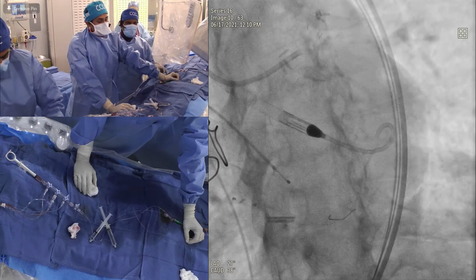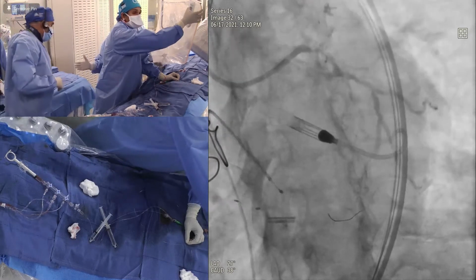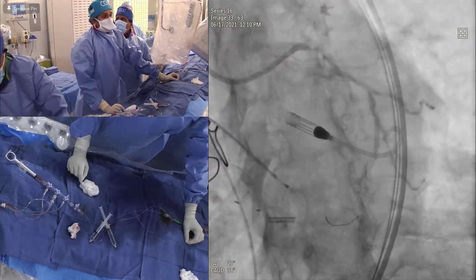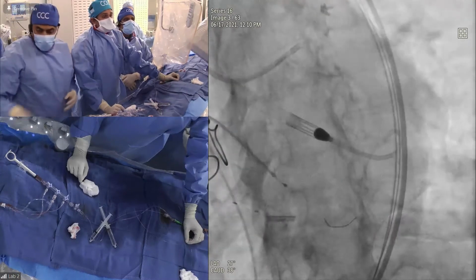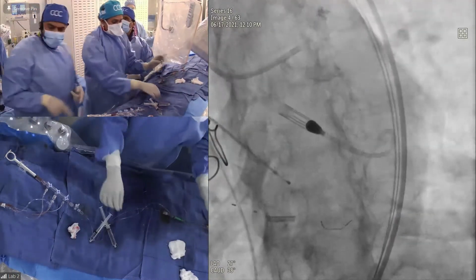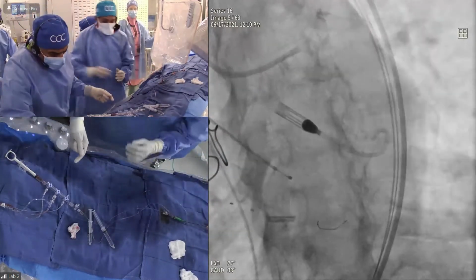That's what Anu is feeling: let's put a wire, let's put your balloon, and if it doesn't expand, you have a RotaWire there, you upgrade to 1.5. I don't think we will go to 1.75 here. Just maybe 1.5. Roxana, can you see the proximal wire bias? Yeah, there's a lot of wire bias. So that's why I'm not too happy about going to 1.5. I mean, it's good if you could get away with the balloon, that would be great.